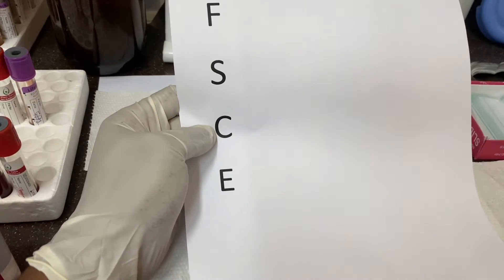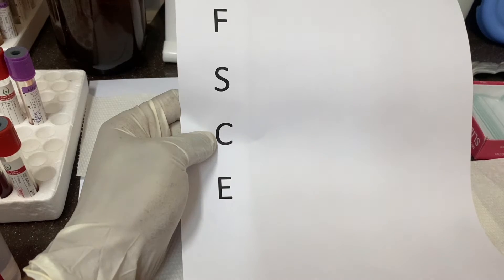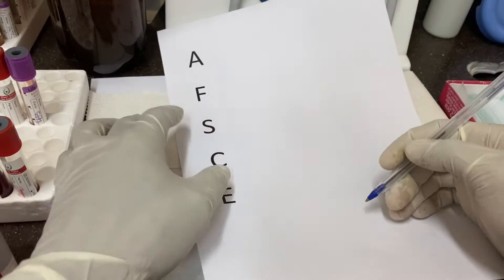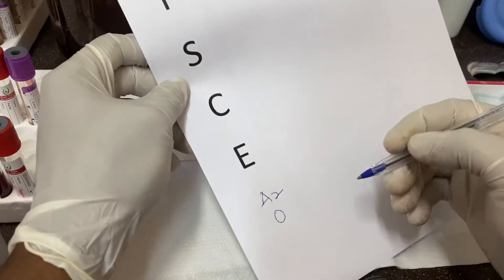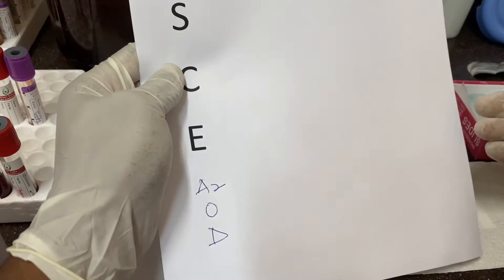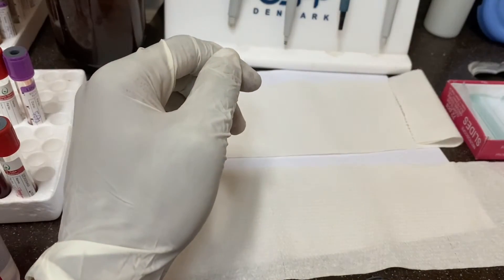We also have hemoglobin E, which is predominant in people in Southeast Asia. We have hemoglobin A2, hemoglobin O, and hemoglobin D — there are many variants. In this video we will quickly demonstrate how this test is performed in the lab, and as the test is running we will talk about the principle and other important things.